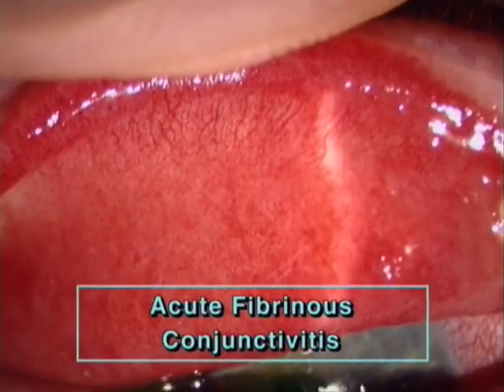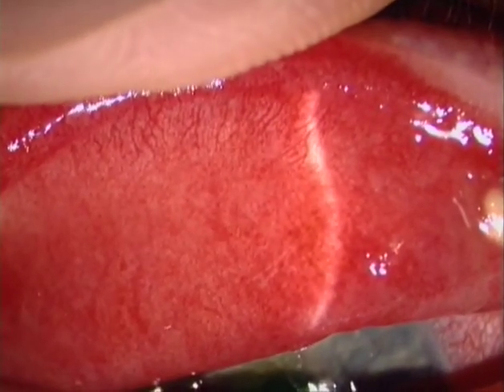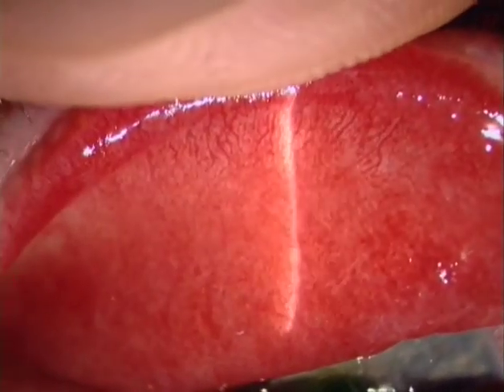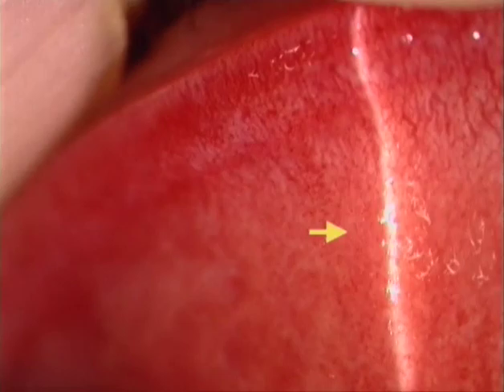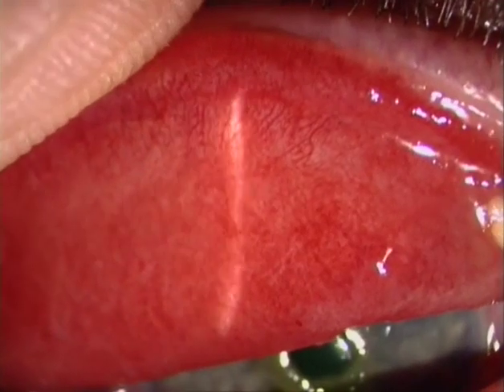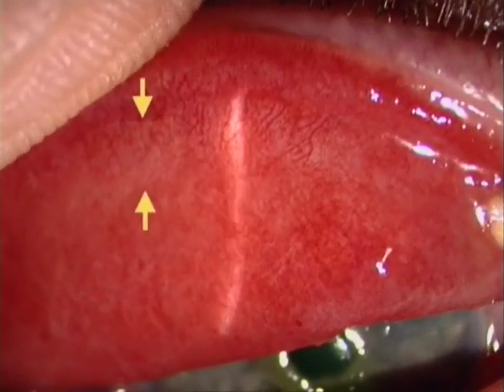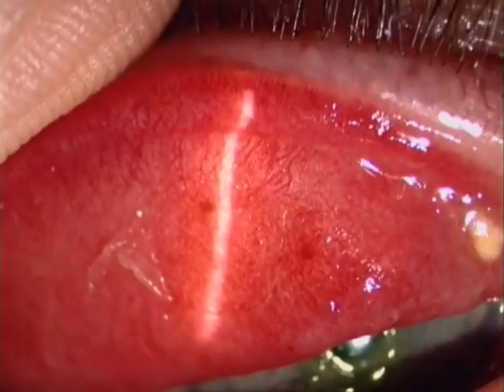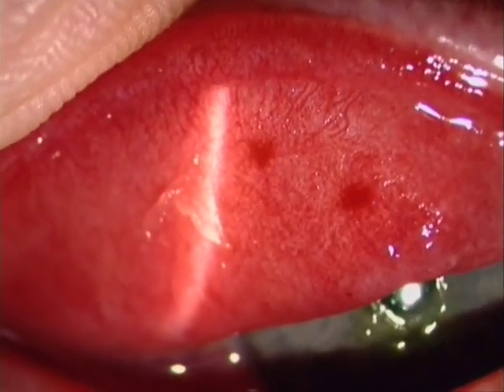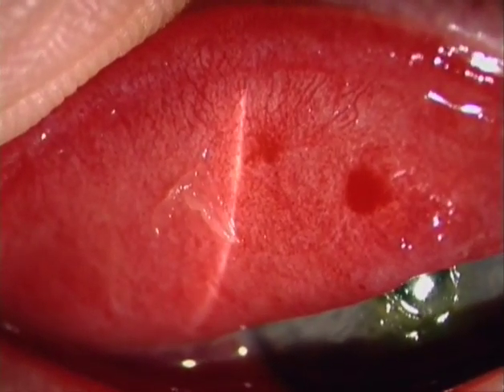In this second case, the membranaceous layer is more difficult to identify because it is thin and its margins are ill-defined. Only the hazy appearance of the underlying vessels points to a covering layer, as seen here. The layer may be better visible after prolonged exposure because, when drying, it becomes slightly more opaque. The layer is more adherent than in the previous case, and its removal leads to bleeding. Where removed, the underlying vessels appear more distinctly. The margins of the remaining layer can be recognized where the visibility of the vessels decreases.